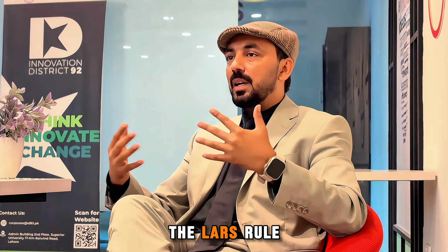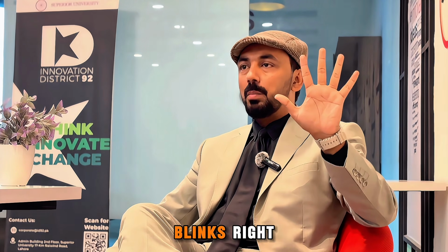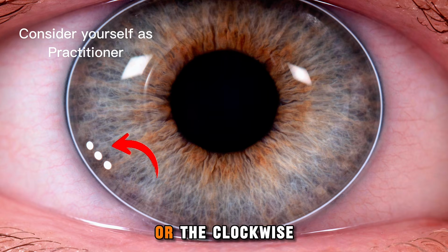But your question was in which conditions we will apply the LARS rule. LA means left add, RS means right subtract. So we will apply the LARS rule if, condition number 1, the lens is at its 6 o'clock position, the normal or appropriate position, and when the patient blinks, the contact lens moves towards the left side with respect to the practitioner, or rotates clockwise. If this is happening, then we will apply the LARS rule.